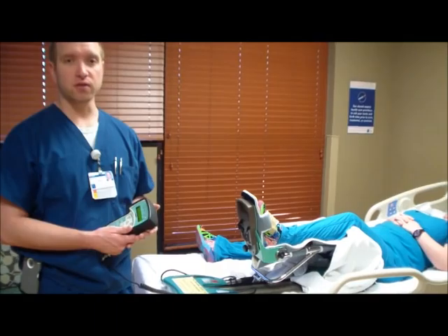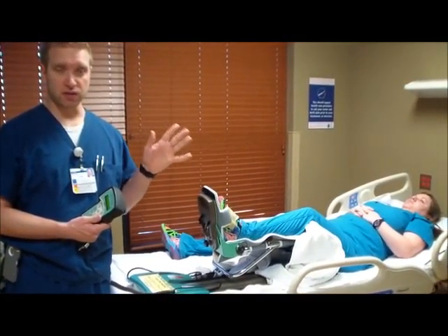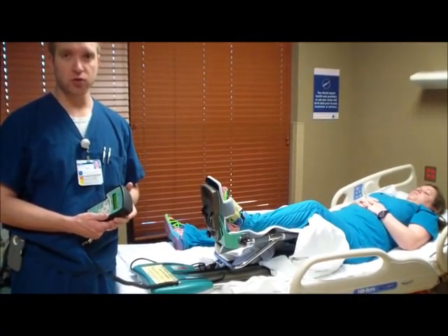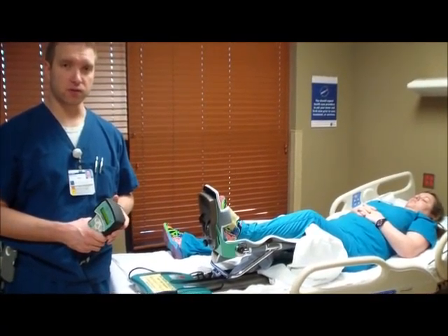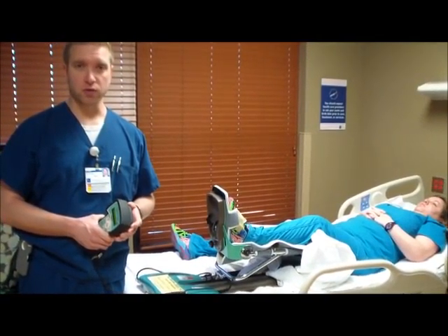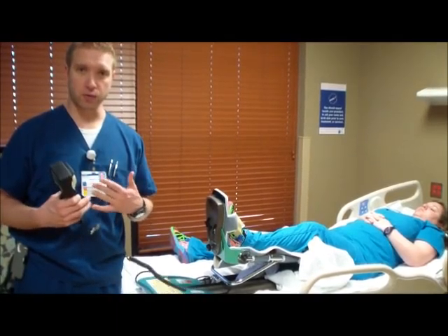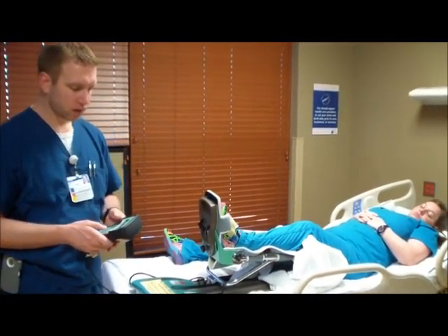However, if the patient is having severe pain, you're unable to get the CPM to go through its full range of motion, you're going to want to contact a physical therapist as soon as possible. It's the therapist's duty as well to make sure we have the CPM on, but also at the same time make sure it's through an adequate range of motion that the patient can tolerate.